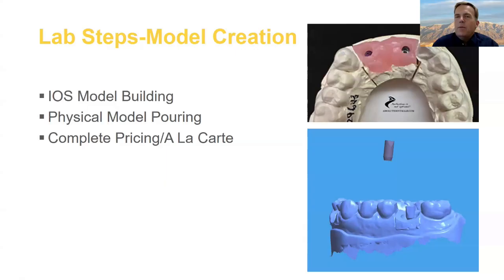And labs, implants are an area where us labs vary greatly. And so when you're trying to decide about pricing from laboratories, make sure you understand what you're buying. Sometimes the lab might have a price and you're like, ooh, that sounds pretty good. But you don't realize it doesn't include a soft tissue model. It doesn't include an analog. Maybe it doesn't even include an abutment, who knows, or a crown. So think about all the things that you need. And sometimes what's nice, if you're trying to compare, is to ask the laboratories that you're considering if they'll generate a dummy invoice. Tell them, I want to do a number 14 implant, send me a dummy invoice. And then that way you can tell what your total pricing is. Sometimes the pricing on the price list can be a little bit misleading, just saying.